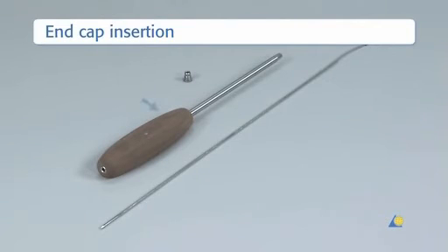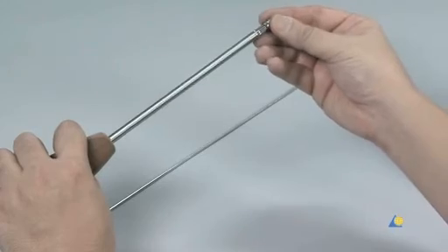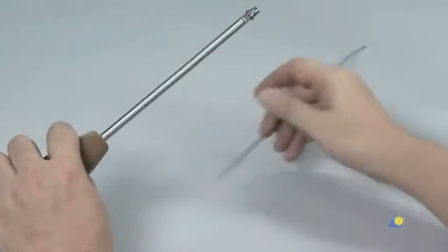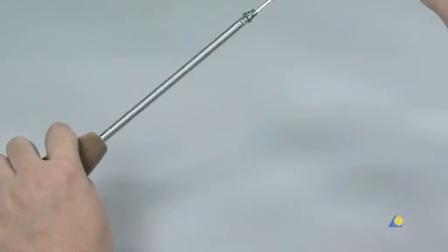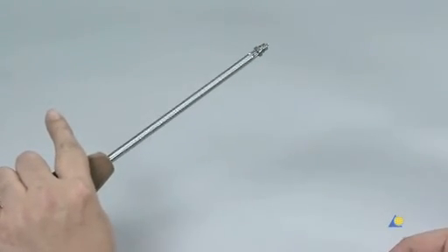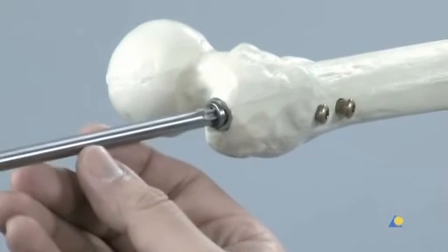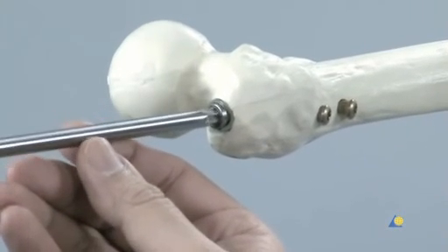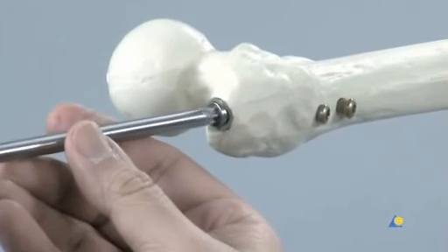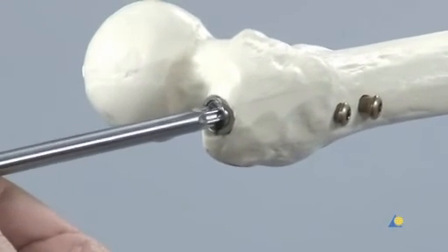To insert the end cap, the cannulated T40 star drive screwdriver and the 2.8mm guide wire with hook are needed. The end cap is fixed on the end of the screwdriver and the blunt end of the guide wire is slid through the end cap and screwdriver; the hook secures the end cap during insertion. To minimise cross-threading, the end cap is turned anti-clockwise until the thread aligns with the nail, then turned clockwise to thread it in. The screwdriver and guide wire are removed.